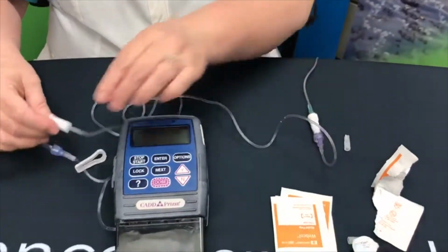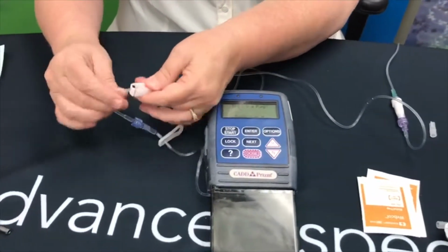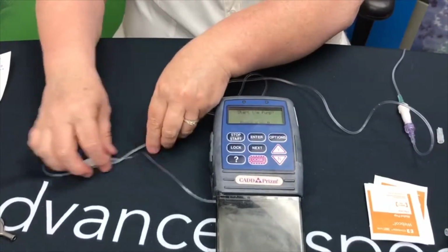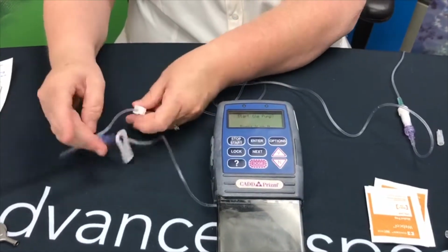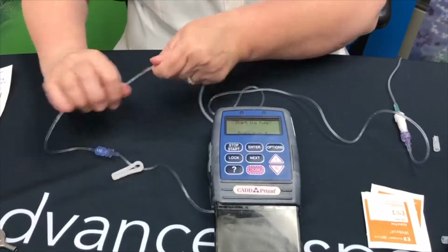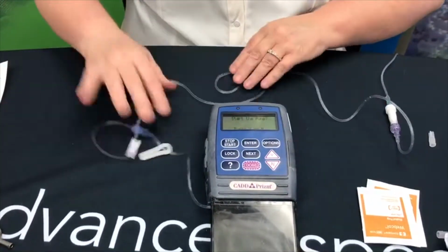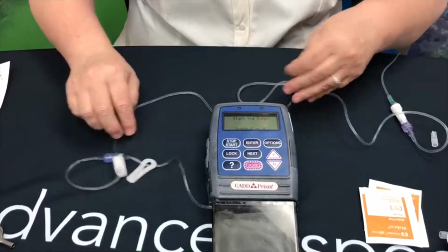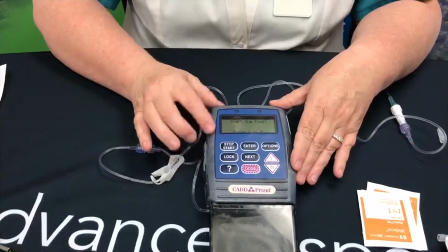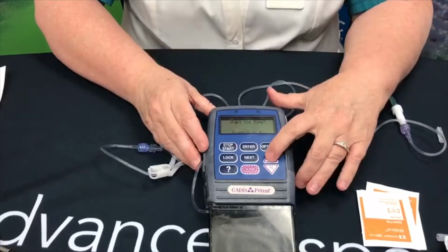Now that it's attached, I'm going to make sure the clamps are open on my pump. If I leave these closed, my pump will give us a high pressure alarm, so we don't want to leave any clamps closed. We also want to make sure that nothing is crimped. Now that I have it attached and the clamps open, it's asking me if I want to start the pump. I'm going to say yes.